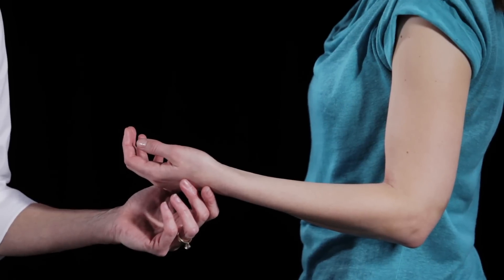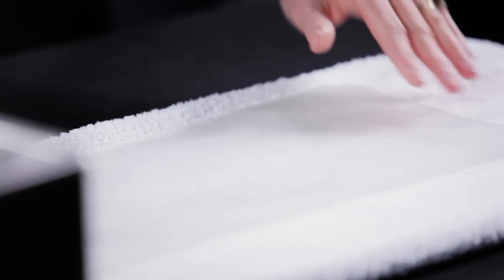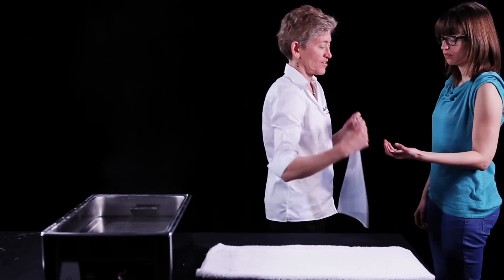The patient can be standing comfortably with the elbow flexed to 90 degrees. The forearm can be in neutral, supination, or pronation depending on the specific diagnosis and treatment plan.